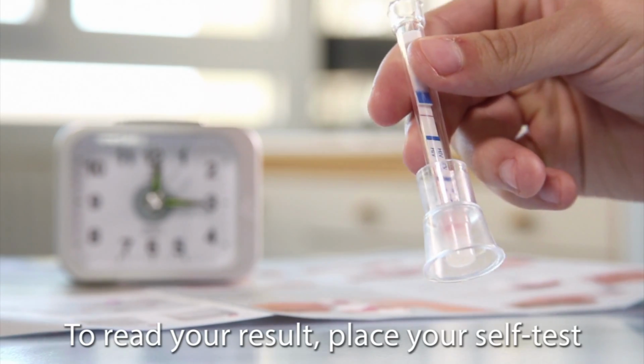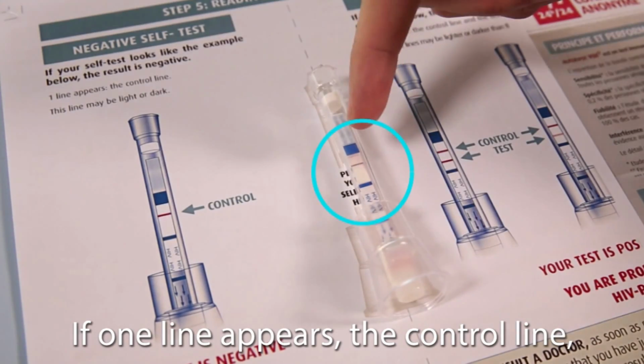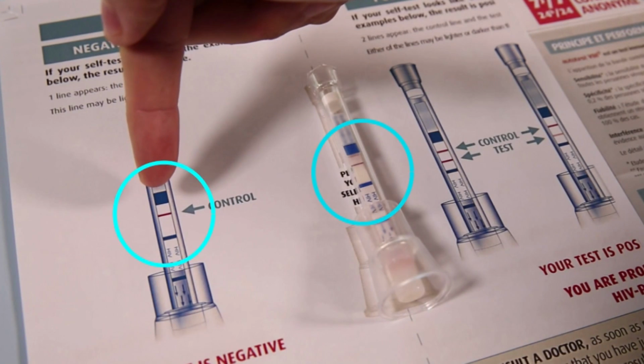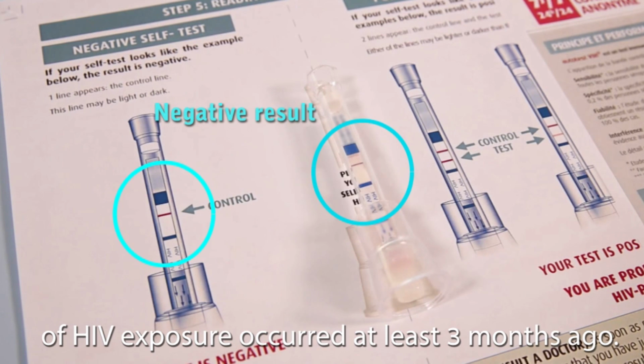To read your results, place your self-test on the space indicated on the instructions for use. If one line appears, the control line, your self-test is negative. You are probably HIV negative if your last risk of HIV exposure occurred at least 3 months ago.